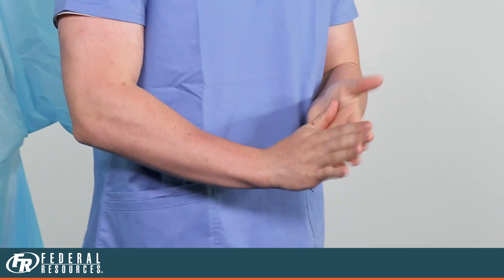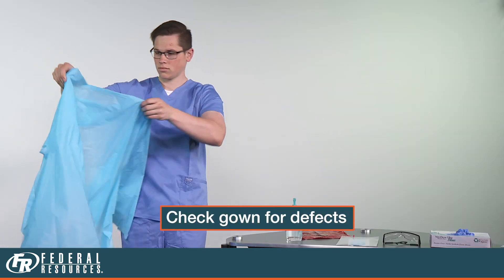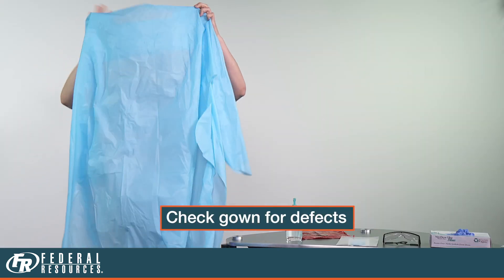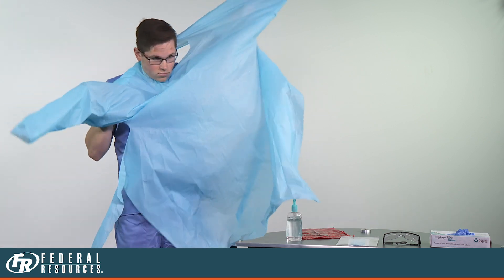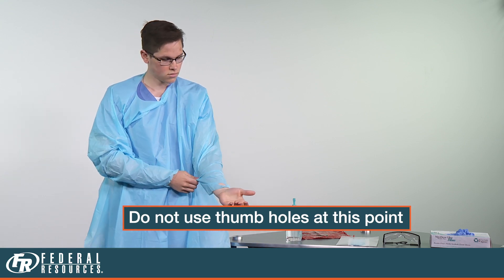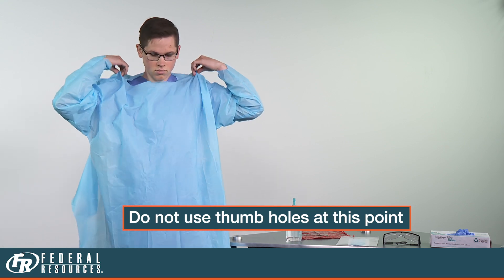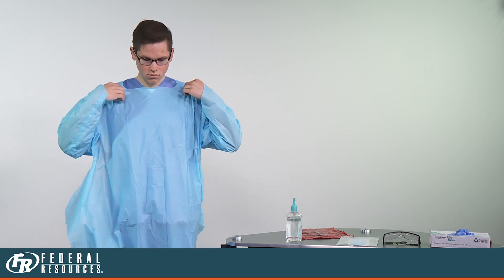Once your hands are dry, you are ready to don your gown. Visually check your gown for defects. If no defects are discovered, place your gown over your head and insert your arms into the sleeves. You will notice you have two thumb holes at the end of your sleeves. These thumb holes will be used prior to donning your gloves to ensure a good seal is created between the gloves and the sleeves.